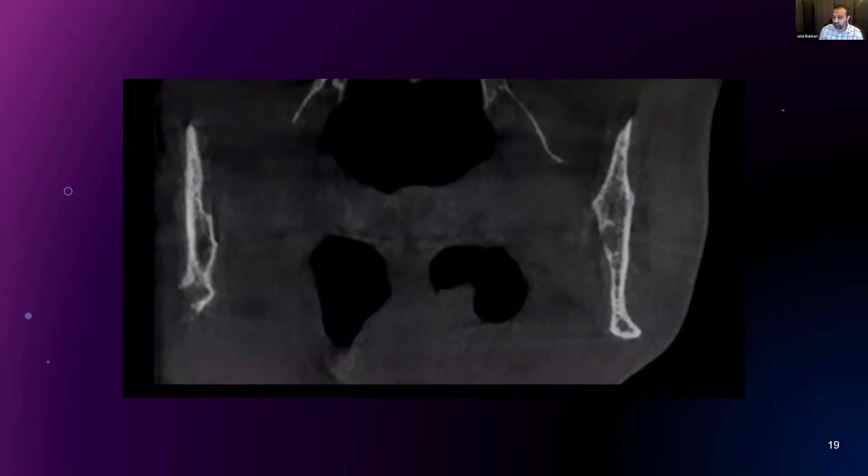And such invasive types of borders may be seen, again, in cases of inflammatory origin or malignant conditions. And such erosive borders come under the umbrella term of ill-defined borders.